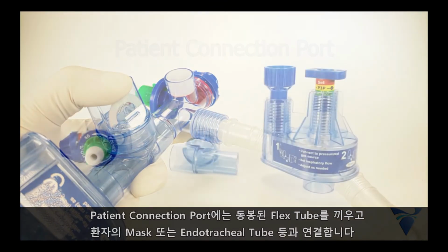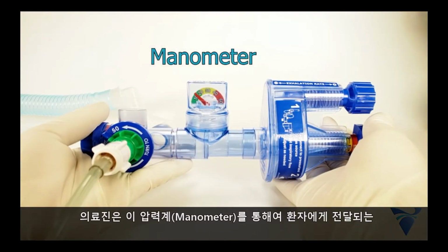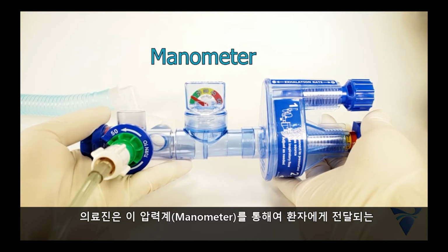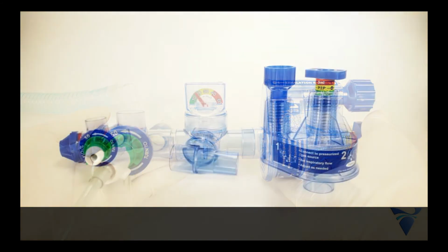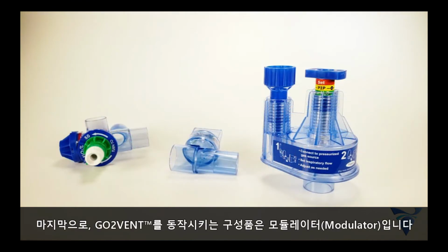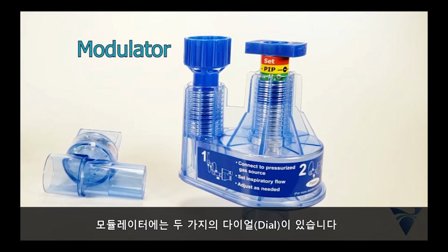tube. The next component is the manometer. The pressure manometer allows the clinician to monitor the current PIP and PEEP settings being delivered to the patient. The control component of the GO2VENT is called the modulator. The modulator consists of two dials.